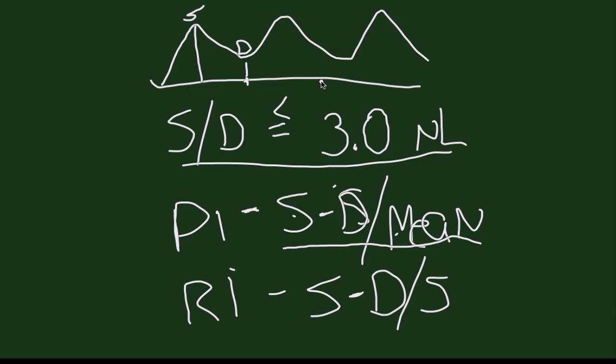So if you have a patient that's 35 weeks and their SD ratio is 3, that's normal. If you have a 35-week patient who has an SD ratio of 4.25, that's not normal. But if the patient's 23 weeks gestation, that's actually normal because we know that the flow through the placenta earlier in gestation is less.